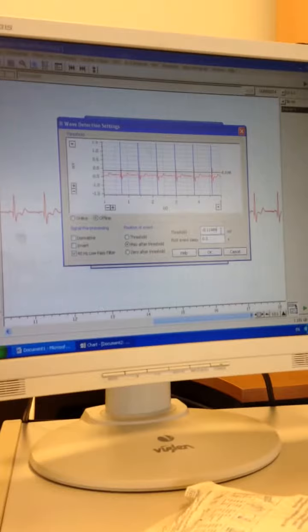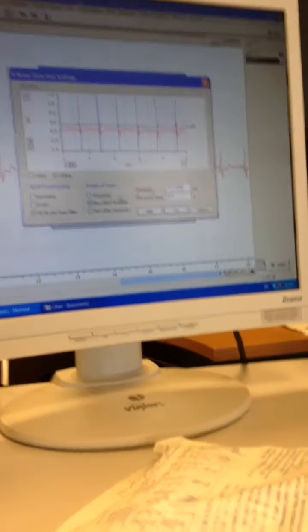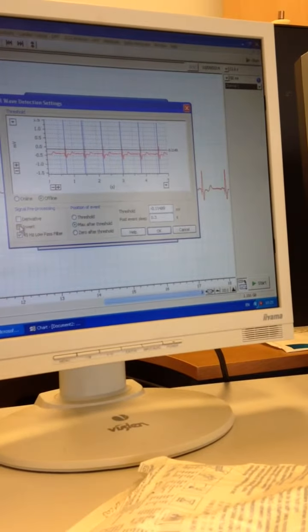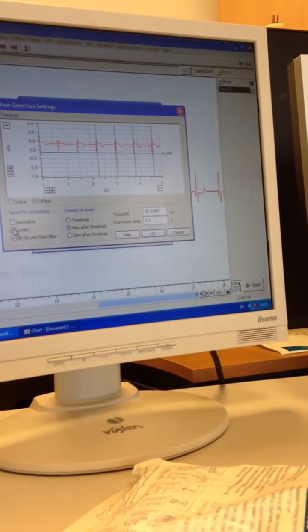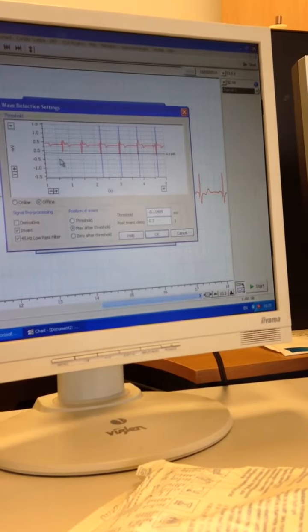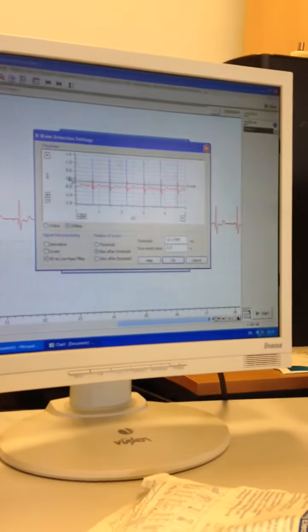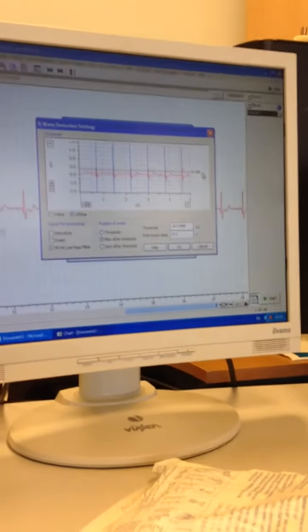Sometimes you have to make sure that this is not inverted. Don't ever invert it, because if you invert it, it won't read your HRV data, because it's going to be reading only minus 0.1149 and below that. So this is cutting off just everything. So don't try and read it, and make sure it's within this value.